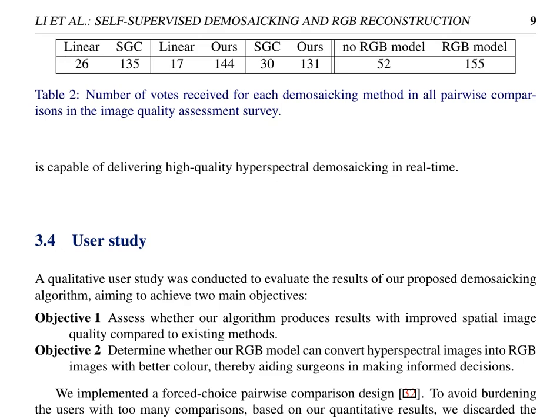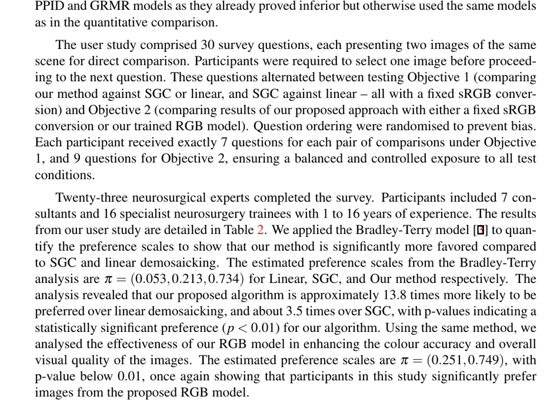This study presents a novel GAN-based approach for medical hyperspectral image demosaicking, which utilizes readily available snapshot mosaic hyperspectral images and surgical microscopy RGB images. The performance of the hyperspectral demosaicking model has been significantly enhanced by introducing the IPS loss and the proposed cycle-consistent adversarial training based on RGB reconstructions. The RGB visualization has been refined through a simple MLP model, effectively compensating for the limited spectral resolution and range typically associated with snapshot mosaic cameras.